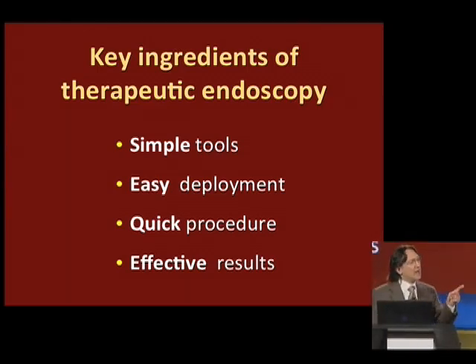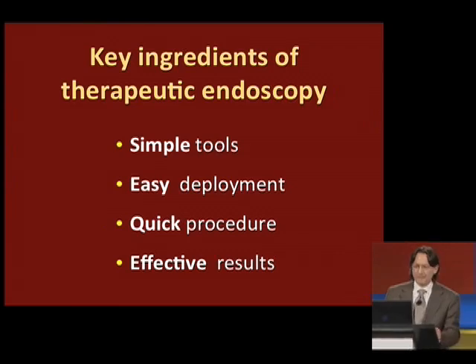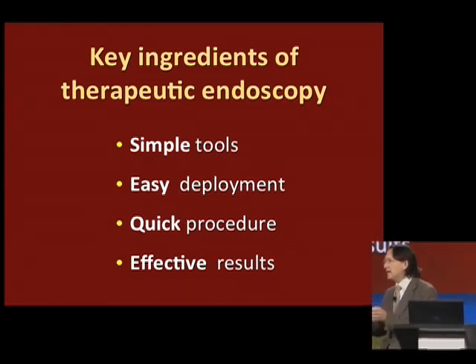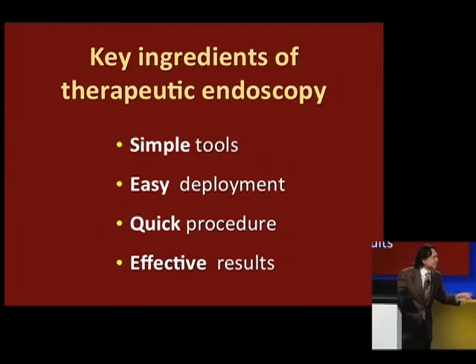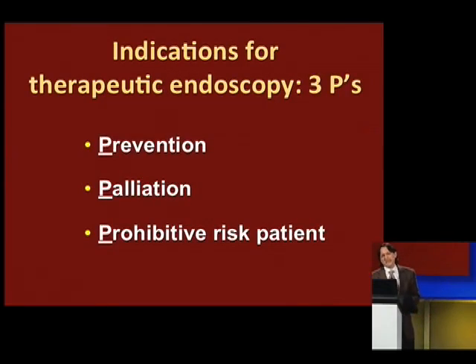And it can be done by a single operator. It's a quick procedure. It can be done in the span of 20 to 30 minutes. And the results are effective. And also effective are the costs. It's cost effective. Now, the indications for therapeutic endoscopy historically has been what I call the 3 Ps.